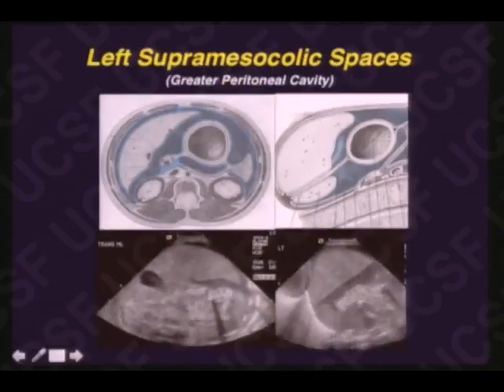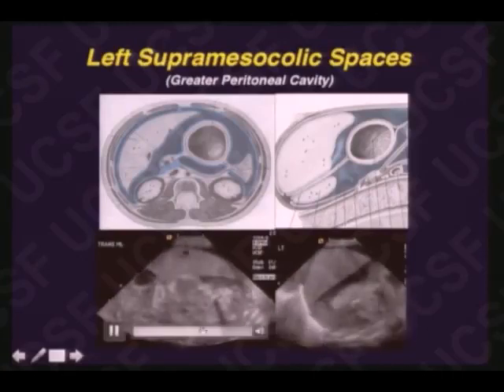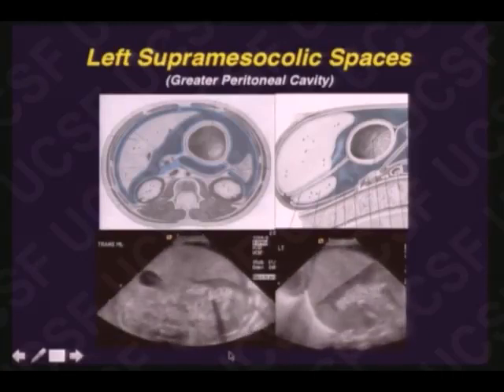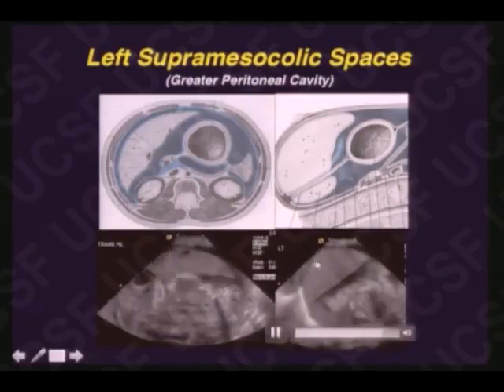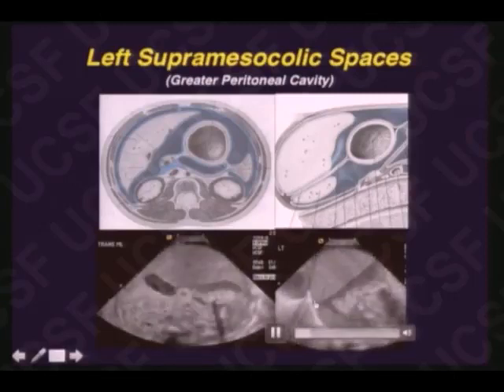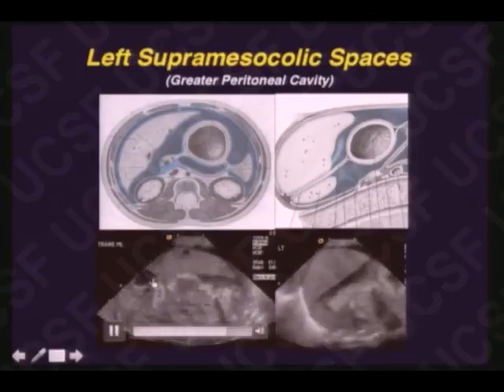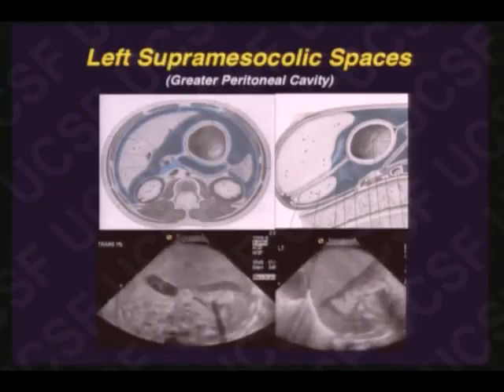Now, in this patient, we're fortunate enough to have a nasogastric tube in the stomach casting that shadow, so we have a very precise localization of the stomach, and you can appreciate that as soon as the beam exited the lateral segment, it had to find this blood in the gastrohepatic recess in this person with a hemoperitoneum.